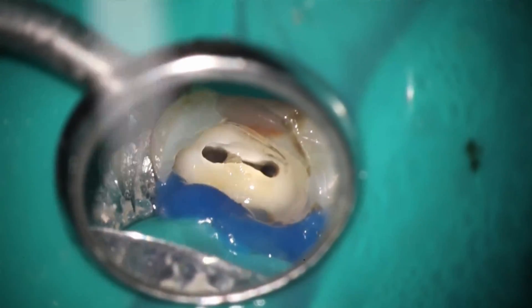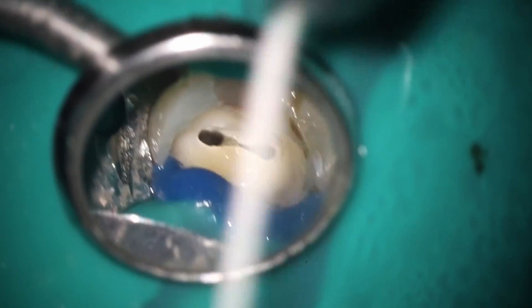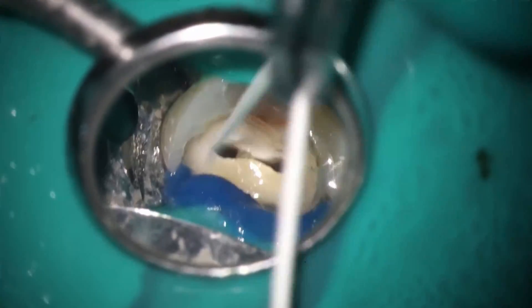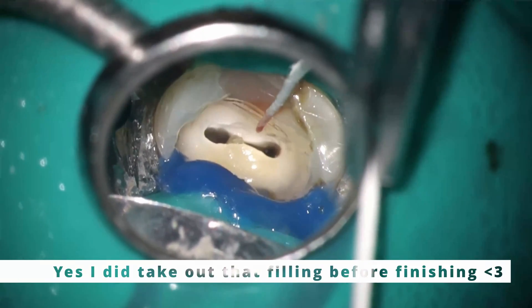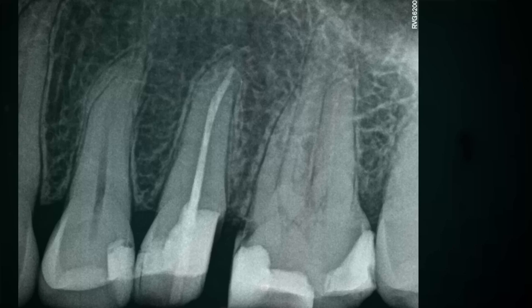Before, it was coming up like crazy with a lot of blood. A little bit at the end there is totally normal. This is where I want to check in and make sure that looks nice and dry. That small little bleeding point is totally normal. We're going to do one more just to confirm. So if you're having trouble getting these canals nice and dry, here's a technique — I hope that works out for you.